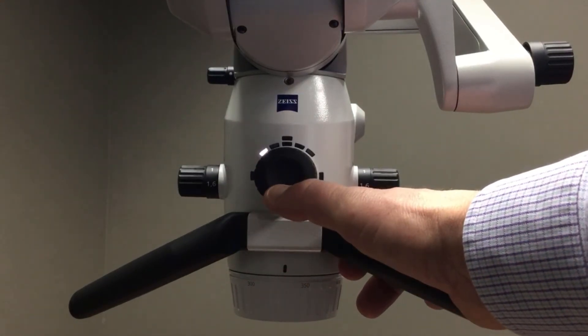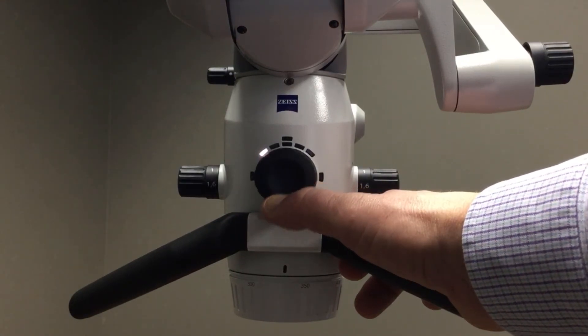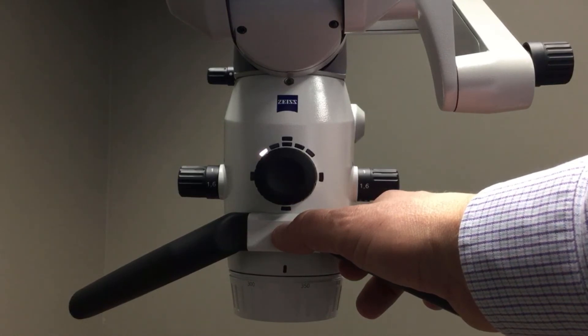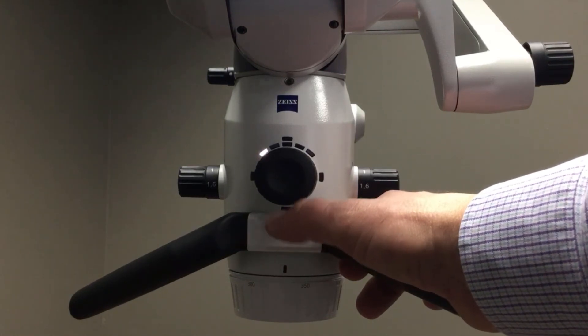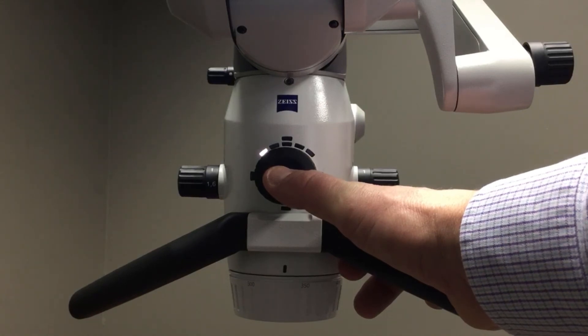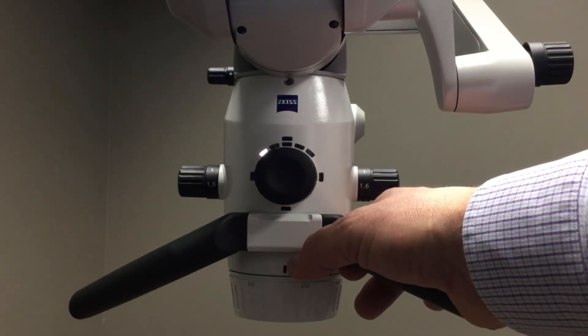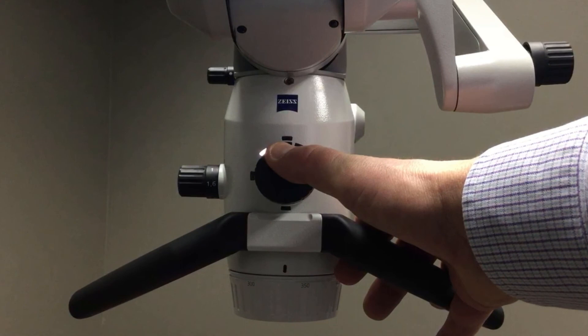If I push and hold the wheel in the six o'clock position, that is going to operate our spotlight function. What spotlight does is it increases or decreases the diameter of the illumination field to provide a more comfortable experience for the patient so you don't have light that gets in their eyes.